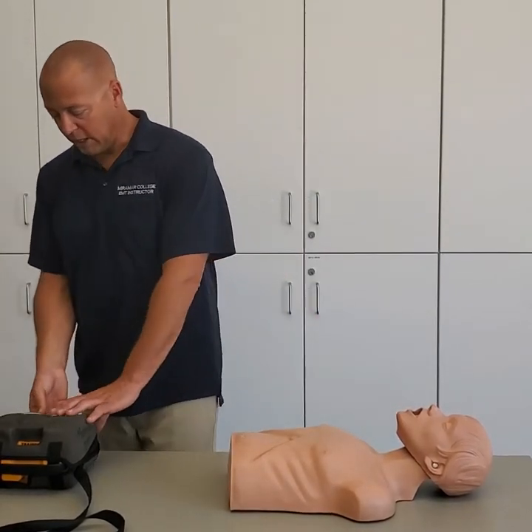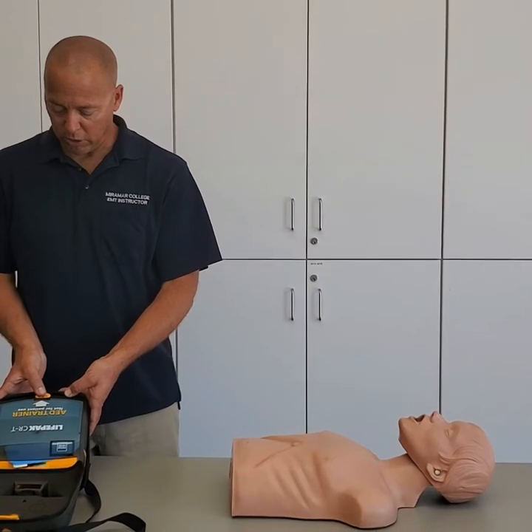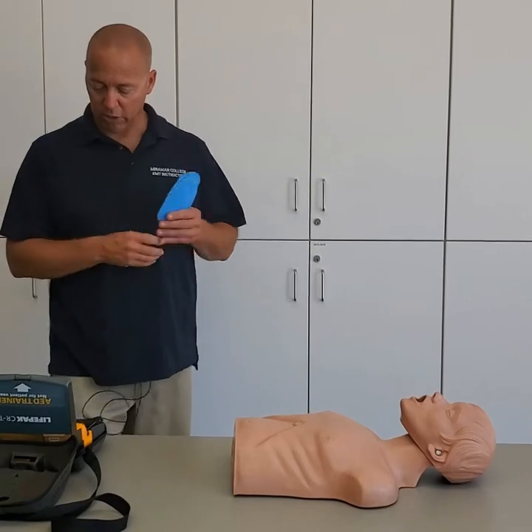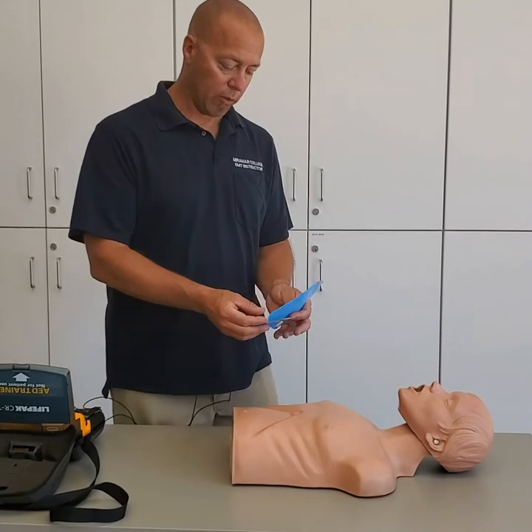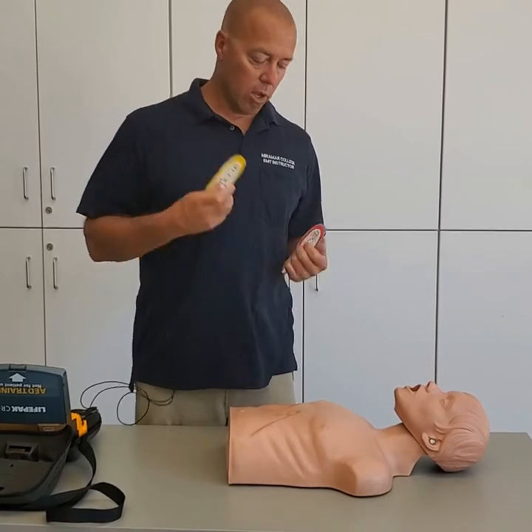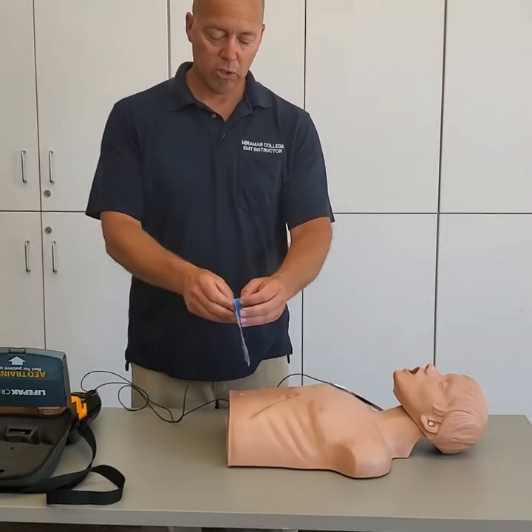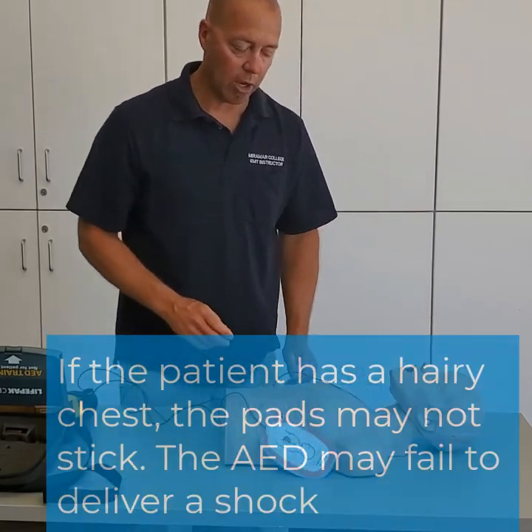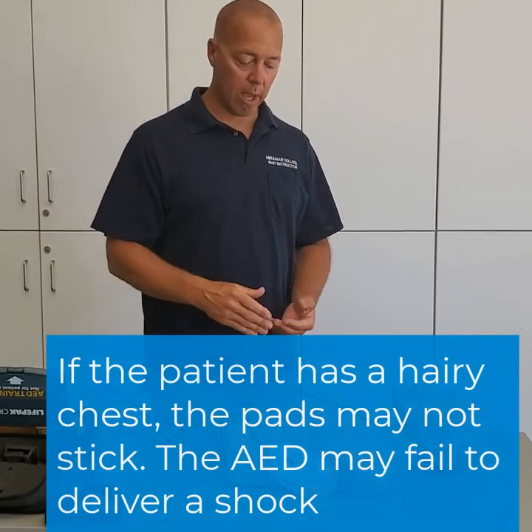Once the AED arrives, the very first thing is to turn it on — these ones have a little on button. Next, apply the pads: one goes on the right upper chest area, one goes on the left lateral ribs. These pads have a sticky back, so peel it off and stick them on to ensure good pad contact. If the patient had a hairy chest, we would shave it first because hair prevents good pad contact.